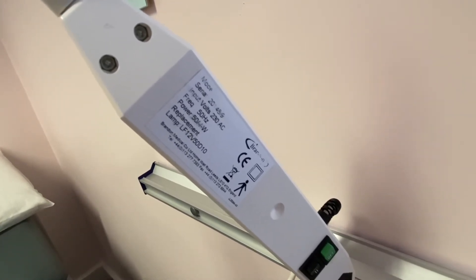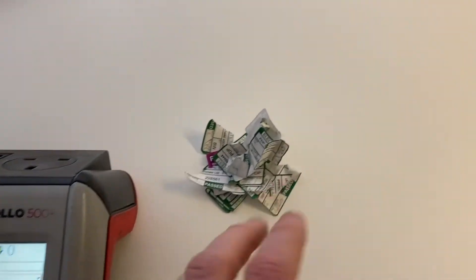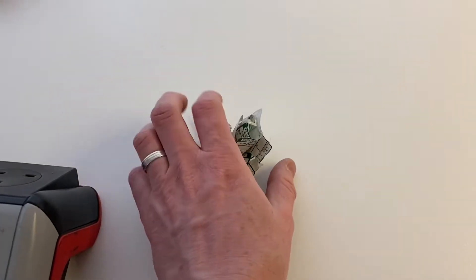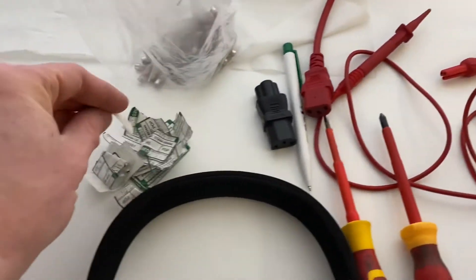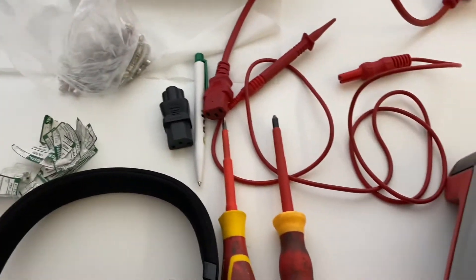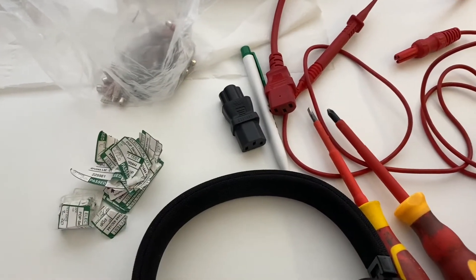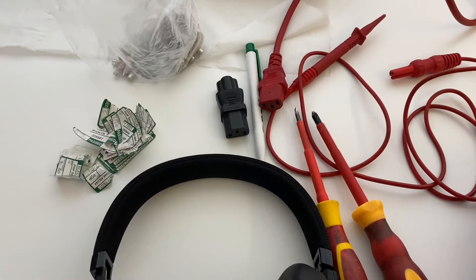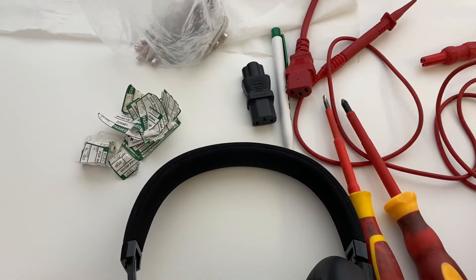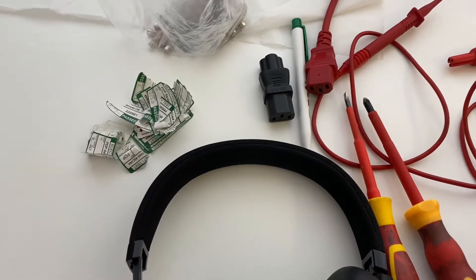Just let the duty holder know that that's the case and away you go. One thing I find when going round is previous PAT testers don't take off the old labels, or they've stuck years and years of labels over, and it just looks messy and really old. For the sake of just taking off the old label and popping on a new one, it looks so much neater. So when you guys are going round, just take the old labels off and put your new label on. And of course if you've got your name on your label, it's good advertising for you — whereas if you keep previous companies' labels on there, they might call that number in future years and you lose out on the job.